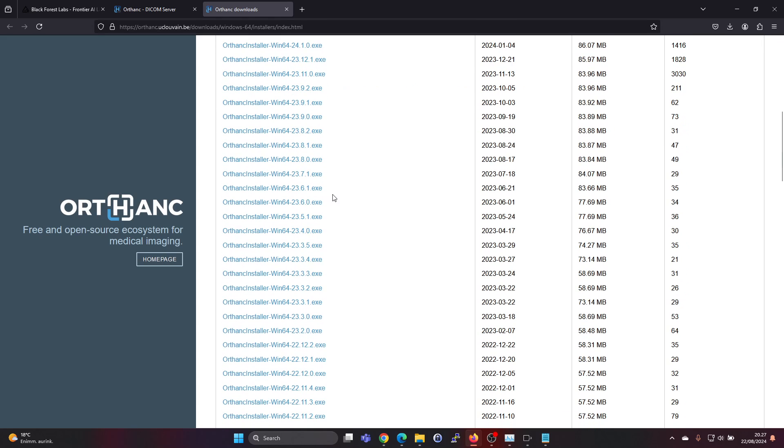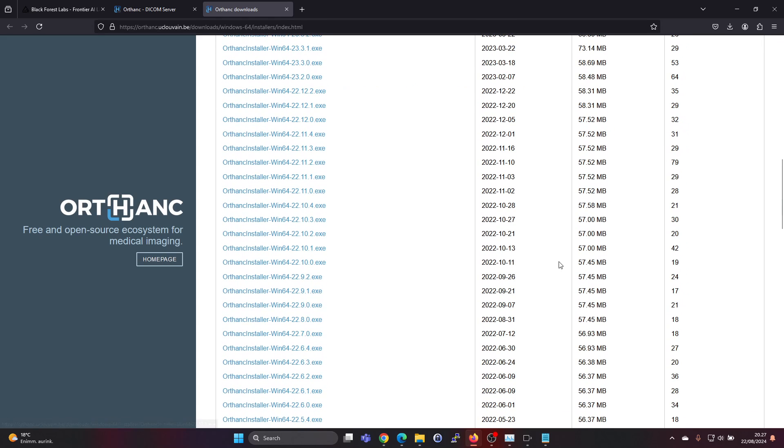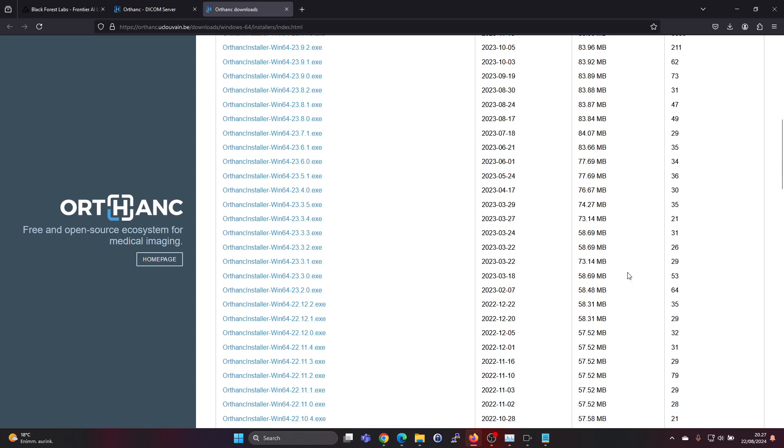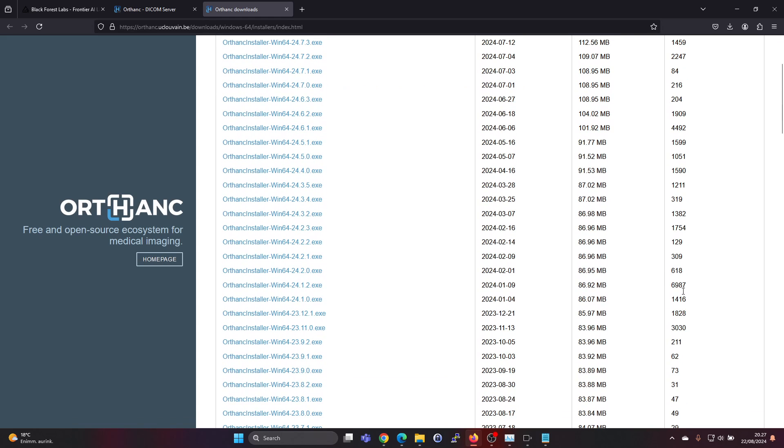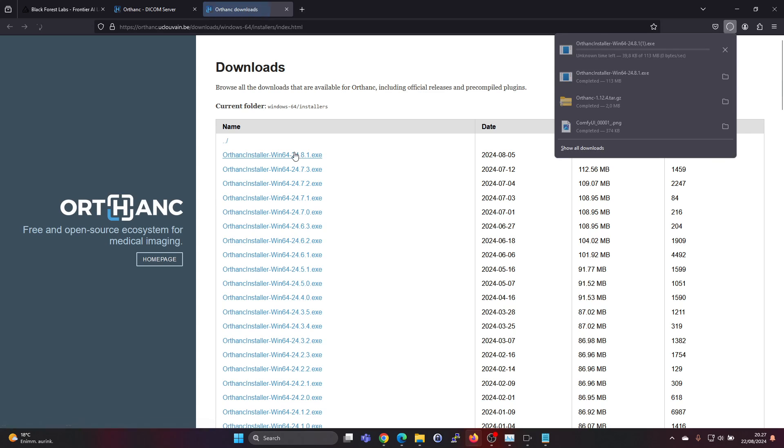Looking at these Windows installer download amounts, it seems it has become quite a bit more popular to download in late '23. So let's download the latest version. It's about 113 megabytes for the installer.